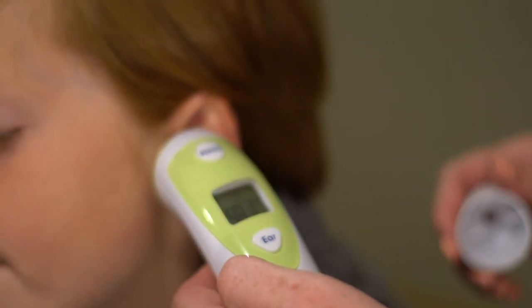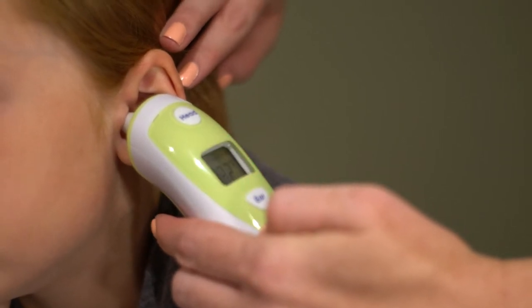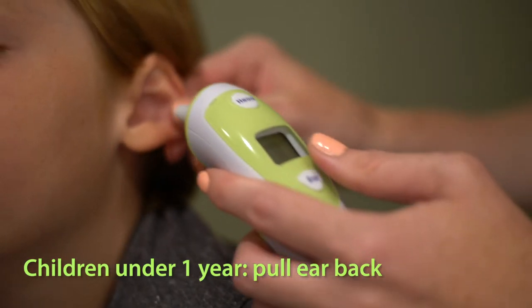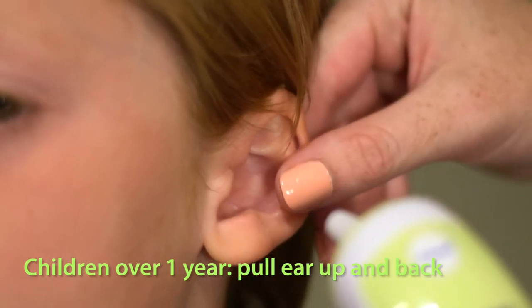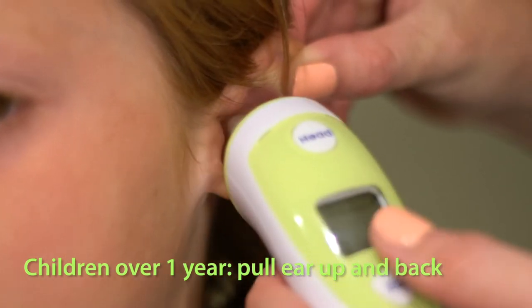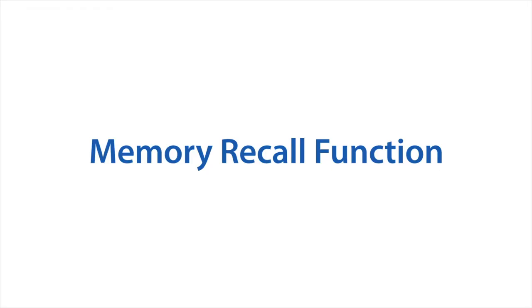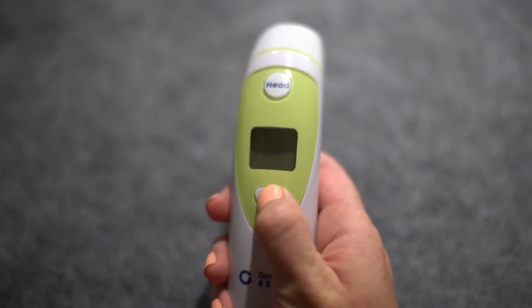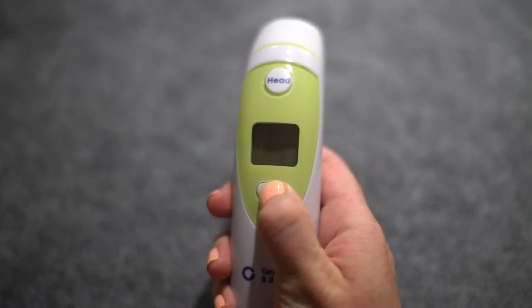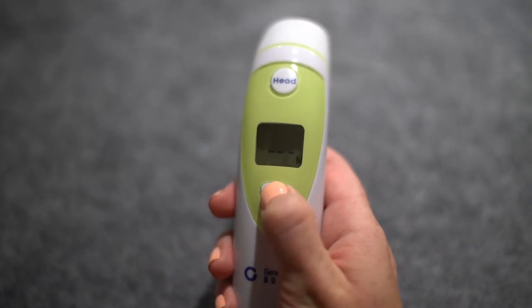When the thermometer is off, the temperature reading is shown on the LCD display. You can take another measurement when the backlight is off. Note: for children under one year, pull the ear straight back. For children aged one year to adult, pull the ear up and back.